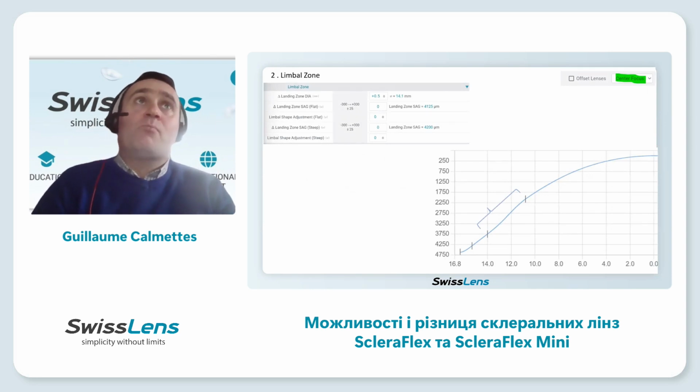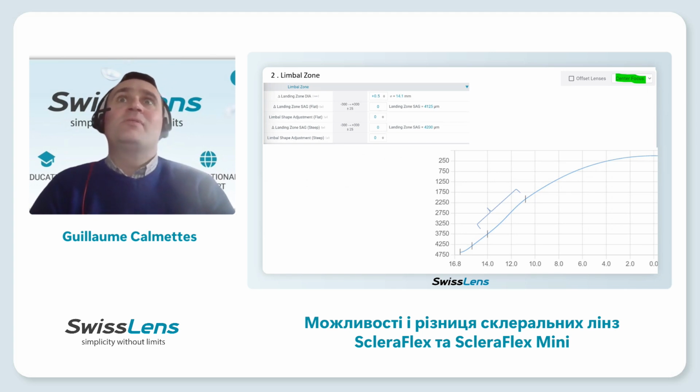Limbal zone. There are more options for the limbal zone, because it's one of the most complicated zones for the patient on the scleral part. That's why we open 3 ways to change this part. I don't have time today to show you exactly the impact of each one. But online, you can play by yourself and understand what happens if you change the diameter, if you change the limbal zone sag, and if you want to change the shape of the limbal zone. And you can play by quadrant.